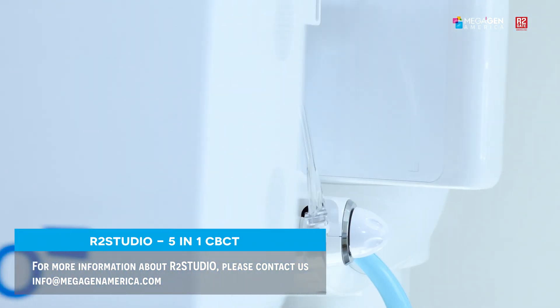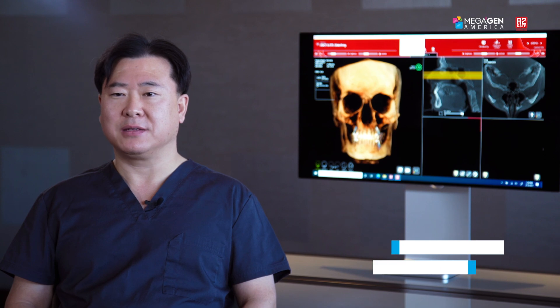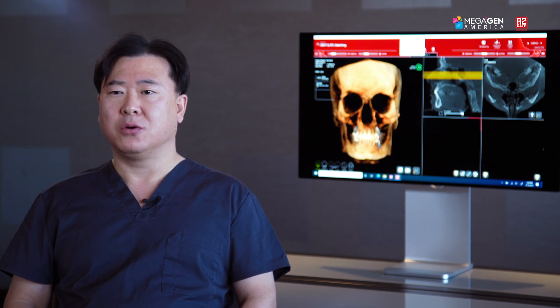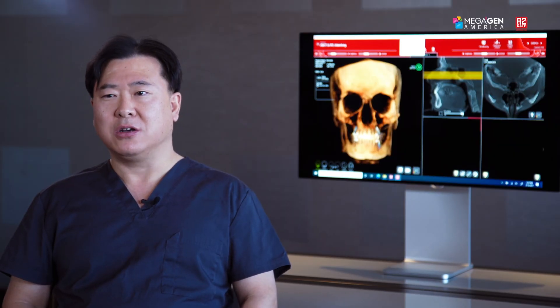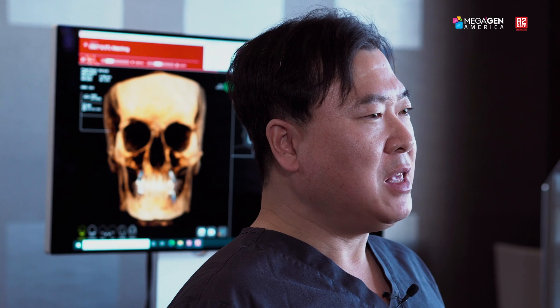R2-GATE was originally developed as a guided surgery planning software more than 10 years ago, and provided the best surgical results due to its precision in STL matching with CT scan data — still surpassing most guided surgical programs in terms of accuracy. As a prosthodontist, I always advocated top-down treatment, and I believe the best surgical result comes from a prosthetically driven treatment plan, especially when dealing with extensive full-arch or full-mouth rehab cases. Now R2-GATE is not only a surgical planning software but also an extremely versatile prosthodontic planning software — if any dentist simply follows the steps laid out in the R2-GATE program, the result will be world class. I guarantee.